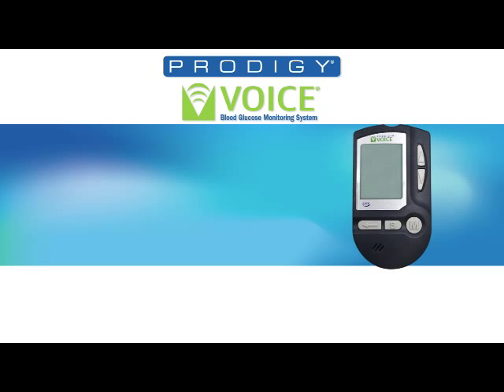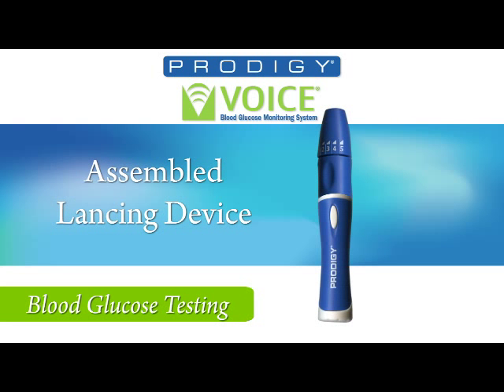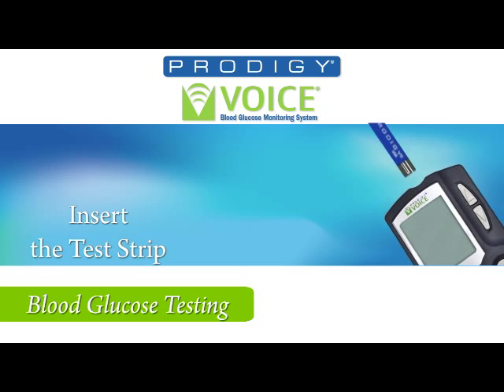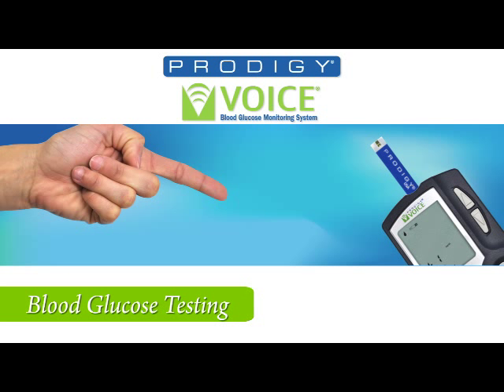Now you are ready to perform a blood glucose test. You'll need your Prodigy Voice Meter, your assembled lancing device, Prodigy No-Coating Test Strips, and a tissue. Insert a test strip into the test strip slot. You will hear: 'Thank you for using Prodigy Voice. Today's date, March 17, 2011. The time, 11:37 PM. Please apply blood to the test strip.'